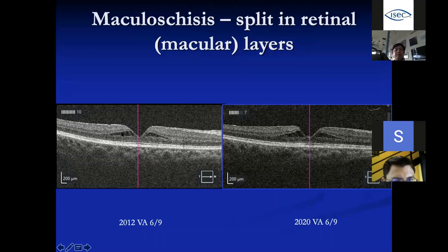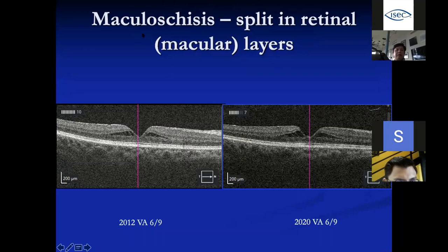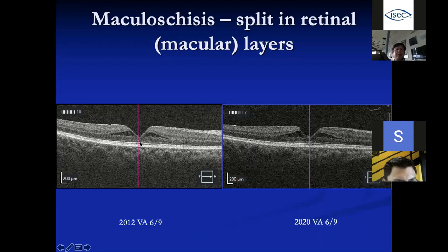Before developing a macular hole, some people develop a split in the retina — macular schisis — which is more common in highly myopic eyes. The abnormal axial length of the eyeball causes stress on the back of the eye. However, not all macular schisis causes visual problems. One patient had schisis from 2012 to 2020 with 6/8 vision and no change — no surgery needed. The key is to look at the outer retinal layer: if it is intact with only the inner layer split, there is no visual problem, and observation is all that is required.